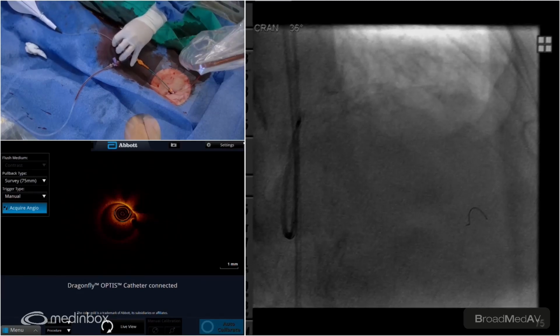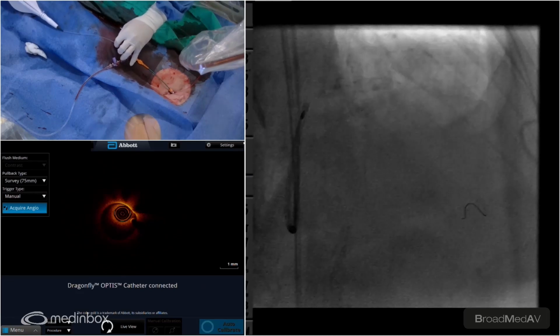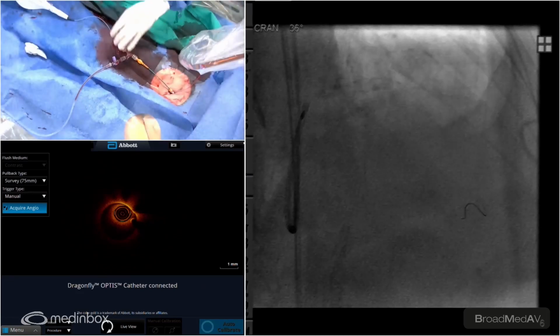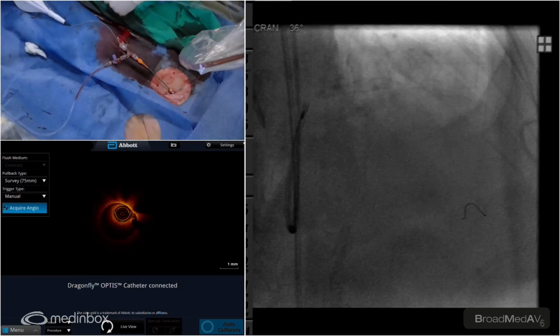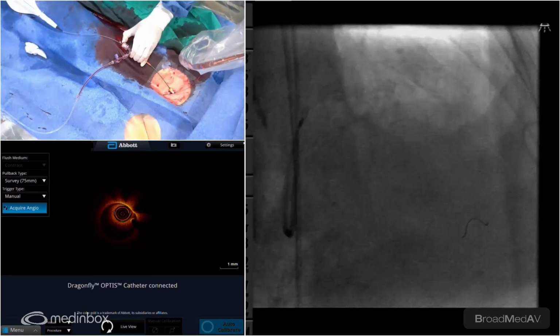And let's do some runs there. The pressure there is not the best. I guess this thing is. Let's get stuck. Let's see. There you go. That's what Arjun was trying to tell me. Okay, good. Let's do some runs here.